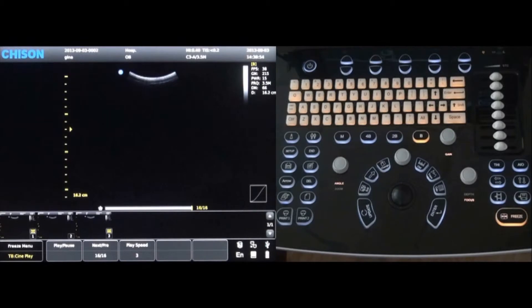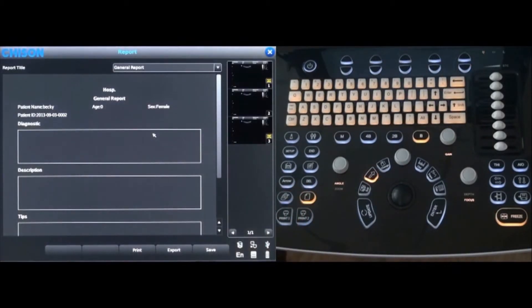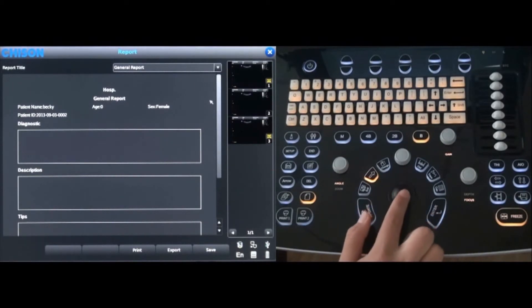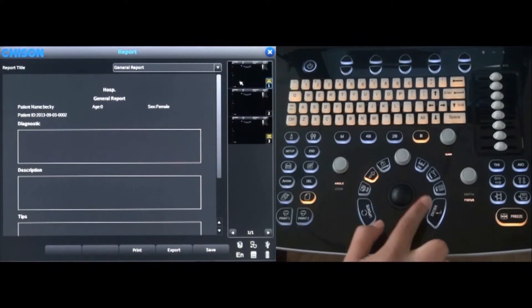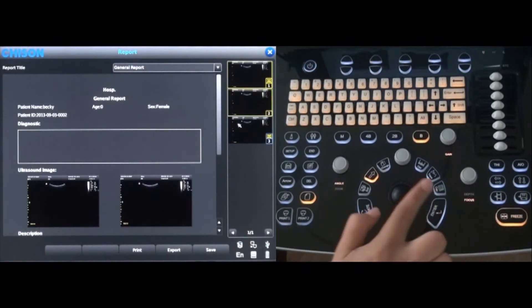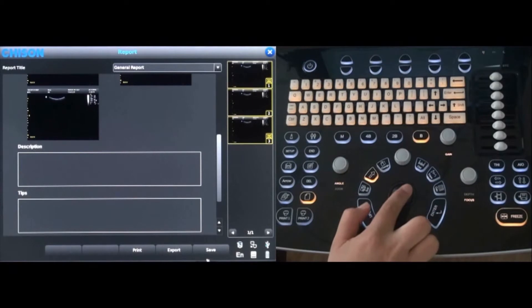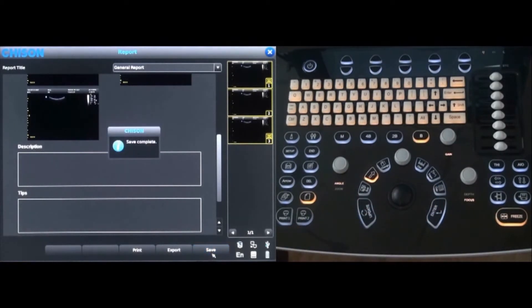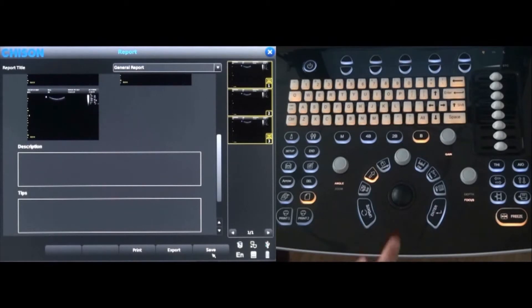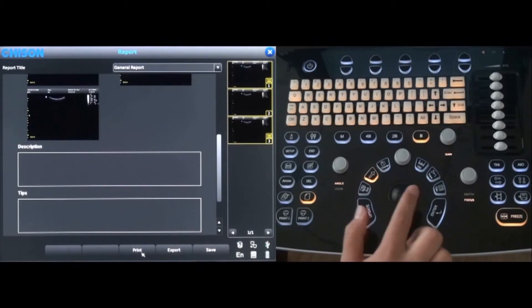Reports can be easily generated by pressing the report key. Images can be added to the report by selecting the desired image with the trackball and pressing the enter key. When the report is complete, select save on the bottom of the screen. The report can also be printed by selecting print, which is also on the bottom of the screen.